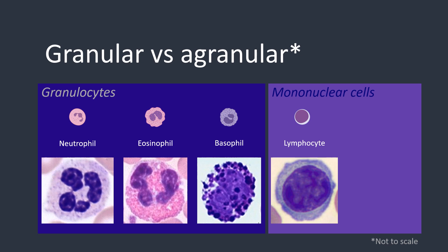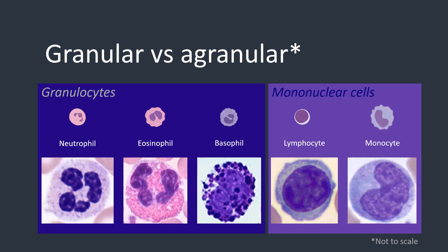Last but by no means least, we have the monocytes. The monocyte is the largest of the normal white cells. The nucleus is irregular and lobulated — it is often described as being kidney bean shaped. The cytoplasm is greyish blue and can contain vacuoles. Monocytes often have an irregular shaped cytoplasm and contain very fine granules.